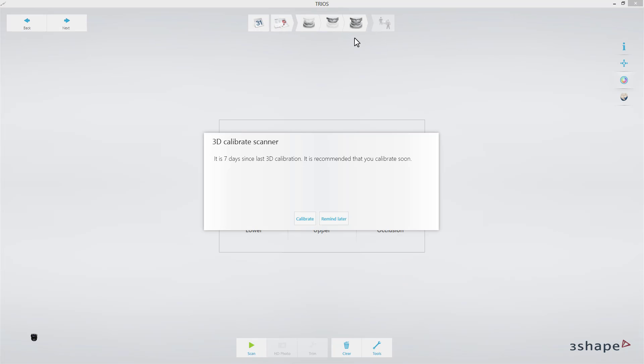There are two ways of initiating calibration, from this message or in the Settings page. Although it is possible to dismiss it, it is not recommended to ignore these warnings.